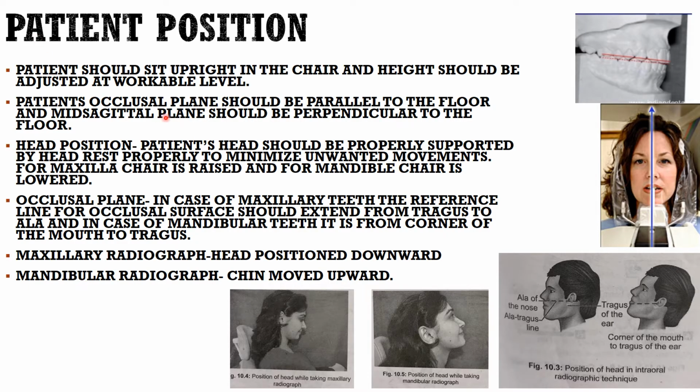The patient's occlusal plane should be parallel to the floor. So this is the occlusal plane and it is parallel to the floor, and the mid-sagittal plane should be perpendicular to the floor. This is the mid-sagittal plane, so it is perpendicular to the floor, and the occlusal plane is parallel to the floor.